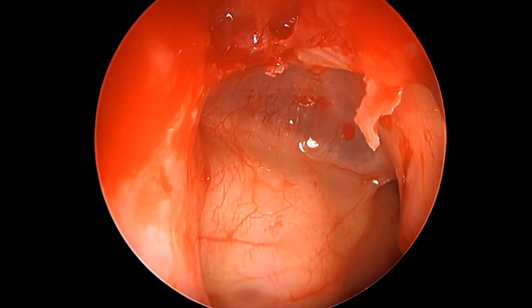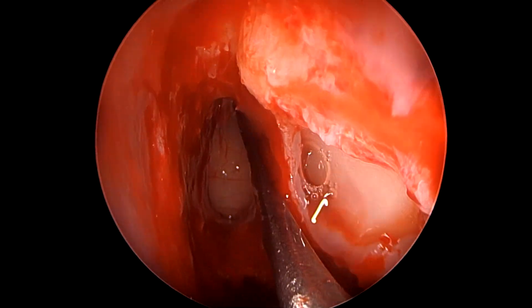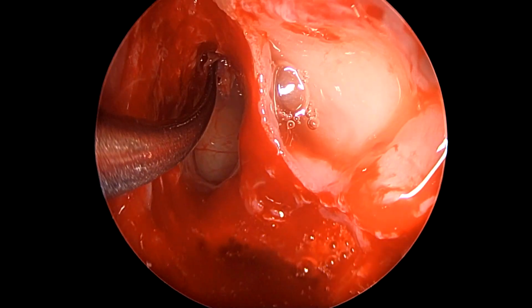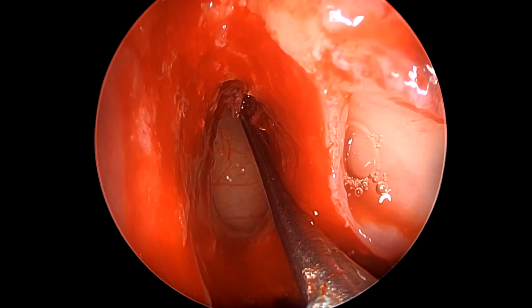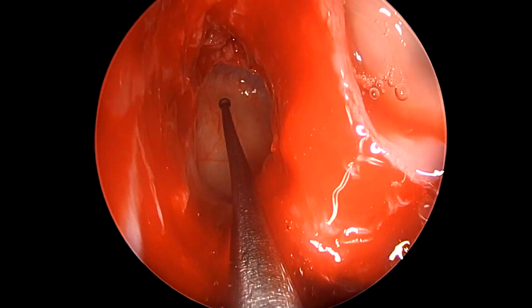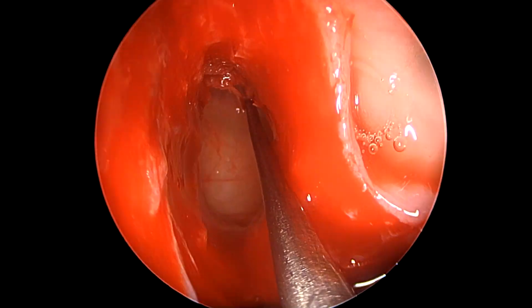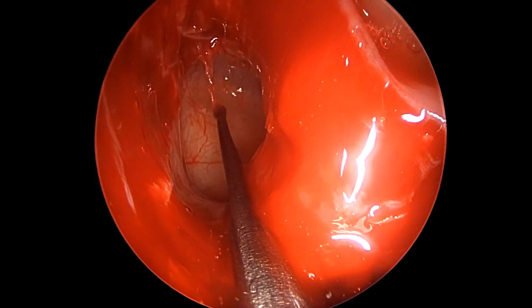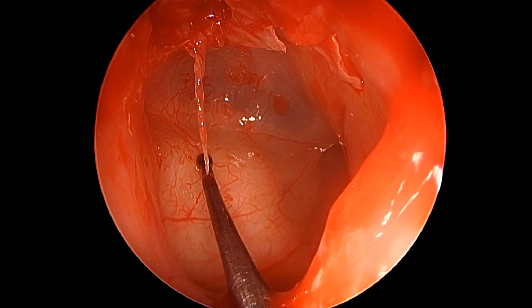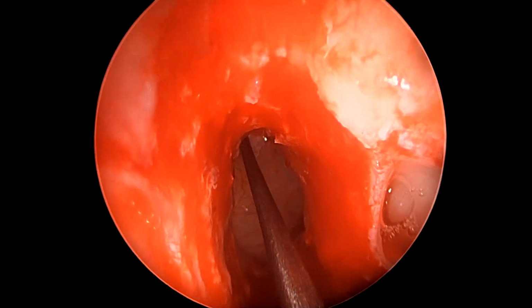Now one must see carefully how well we can see inside this bullar cell. And we must not forget that the large entry that we see here is inside the frontal bullar cell, and this is the anterior wall of the frontal bullar cell, which we are negotiating with the ball probe. And though the ball probe is easily going inside the frontal sinus, anterior to this wall, we still are trying to break the posterior wall of this cell conclusively.